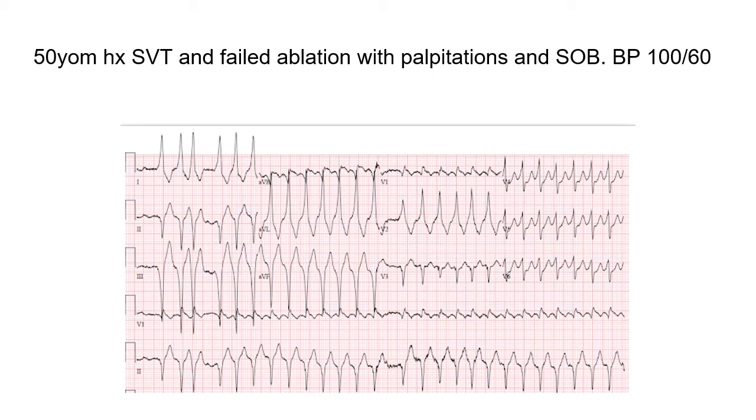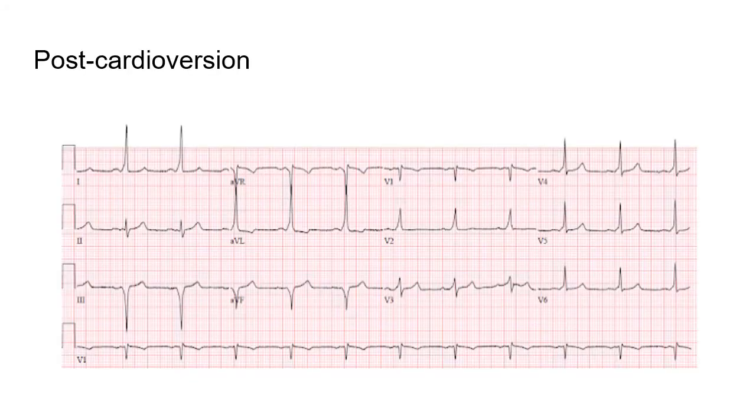So I would say it's wide. And is it regular or irregular? It looks irregular. So in a wide irregular tachycardia, we would get worried about Wolff-Parkinson-White or an issue like that. So we would not want to do AV nodal blockers unless we were certain what the patient's history was.